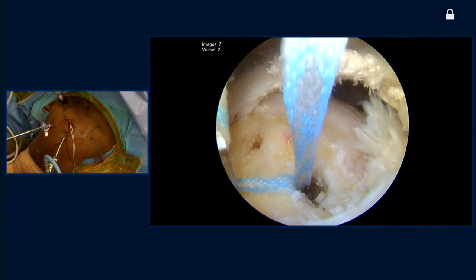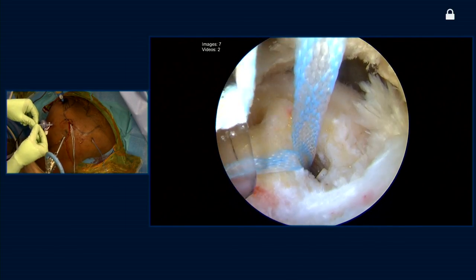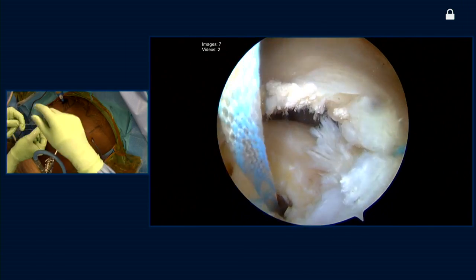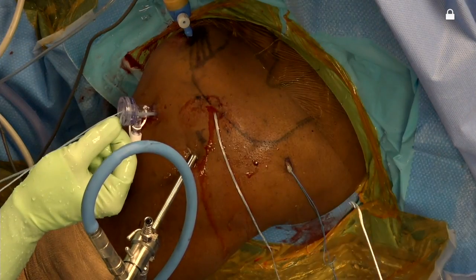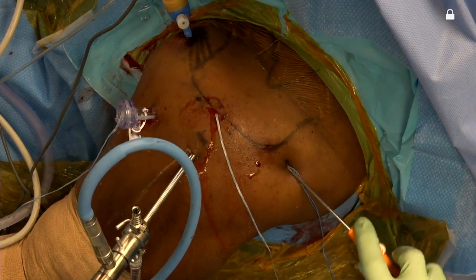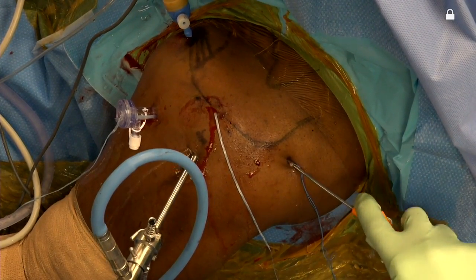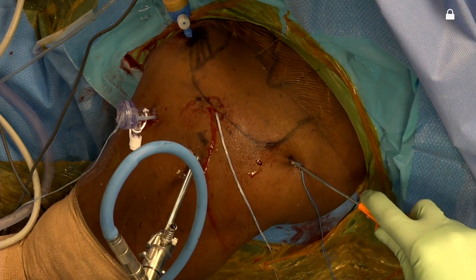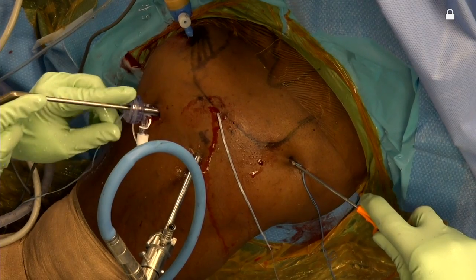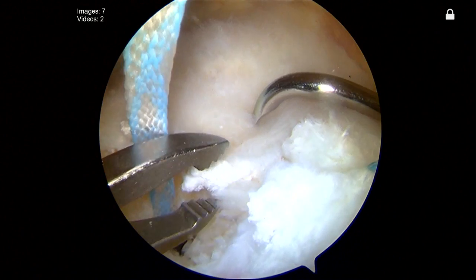The next step is we're going to pass our tapes. We use an ACUPAS device to begin placing some mattress sutures through the rotator cuff. Rachel is going to help me by using a grasping-type device to be able to reduce the tendon into an anatomic position, and that way I can choose my position for putting these tapes through.